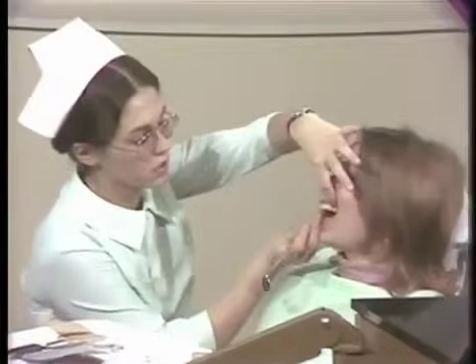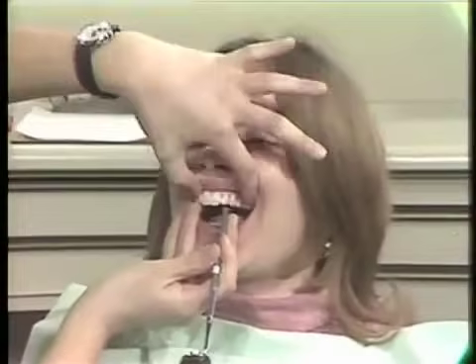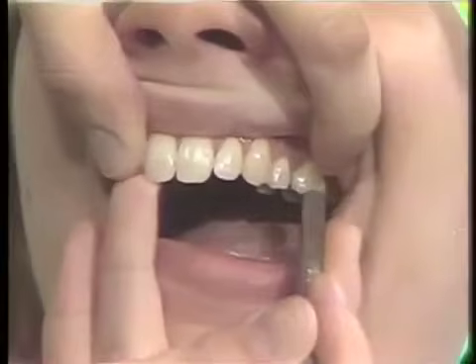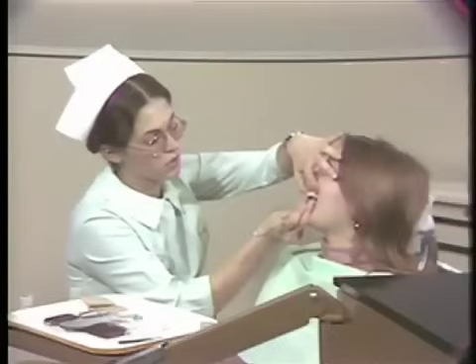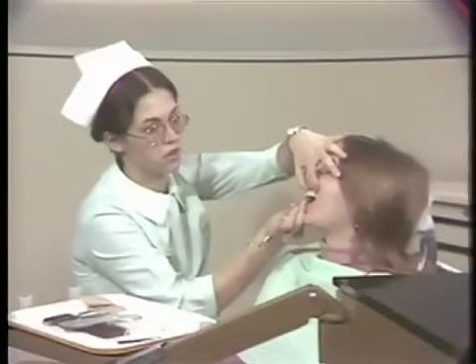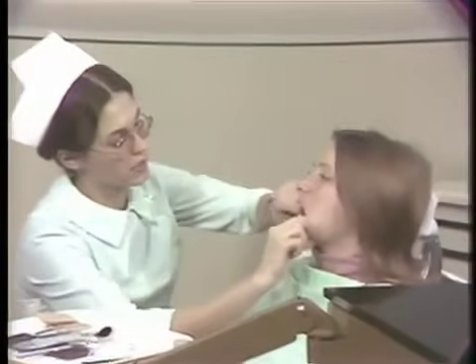A further check of the teeth is percussion of these individual teeth. Normal teeth with normal roots usually give a sharp click. Notice the difference in sound in this tooth, and then this tooth. When we notice such a difference, we can check further. Would you bite your back teeth together?